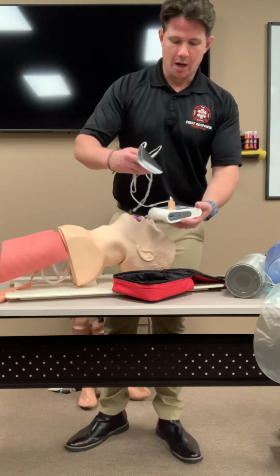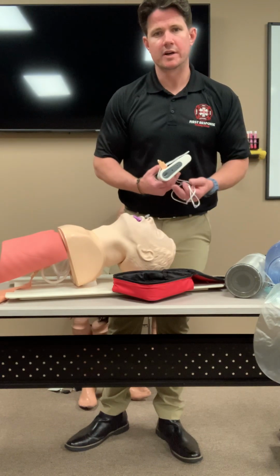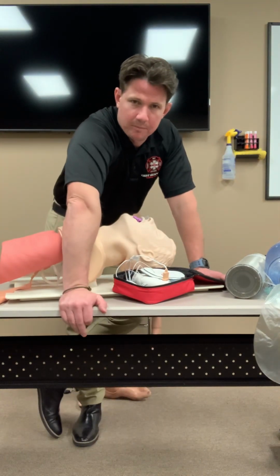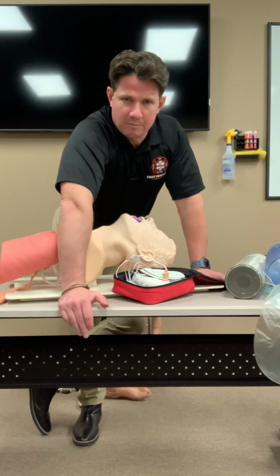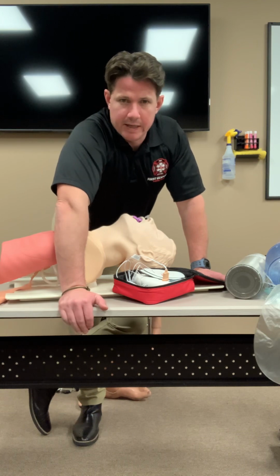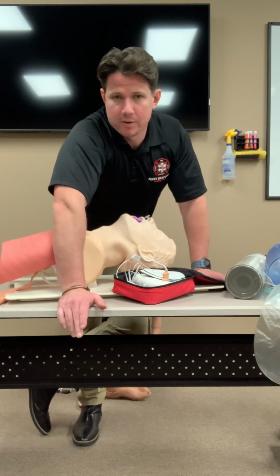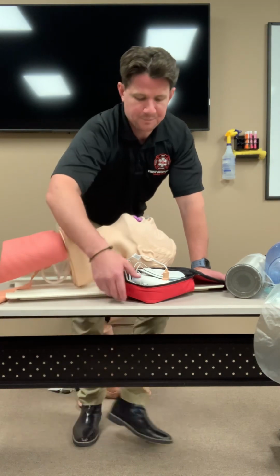So the AED scenario is very simple, very easy, very quick. One thing I'll tell you is after 2 minutes of CPR is up and it analyzes again and it says no shock advised, make sure that before you go right back into CPR, you check for a pulse, right? Because you only shock 2 rhythms, and if it doesn't advise a shock, it could mean that the patient has a pulse. They may not have a pulse. In that event, you'll just continue CPR again, okay?